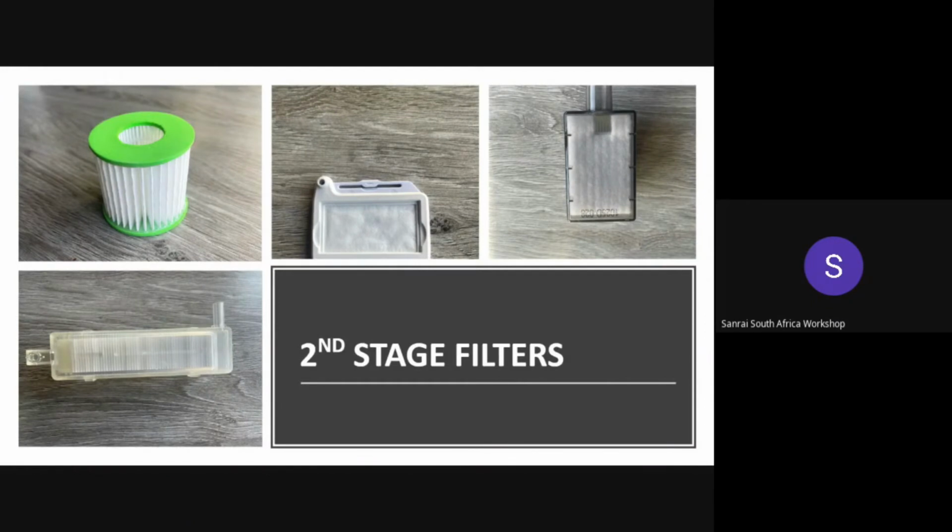These filters, the HEPA filters and the paper filters, are found in stationary concentrators, and they are located in the filter house, where the cabinet can easily be opened and removed to clean the area or to replace the filter. The HEPA filters should not be interchanged between different models of concentrators. As much as the design might look alike or might fit into the machine that you are using, you should not interchange them, in order to prevent premature breakdown of the concentrator due to overheating.